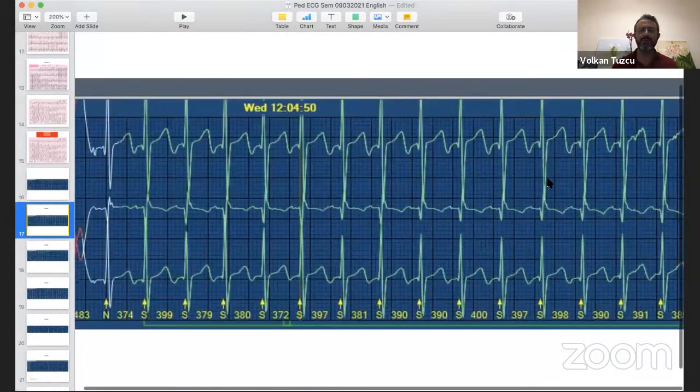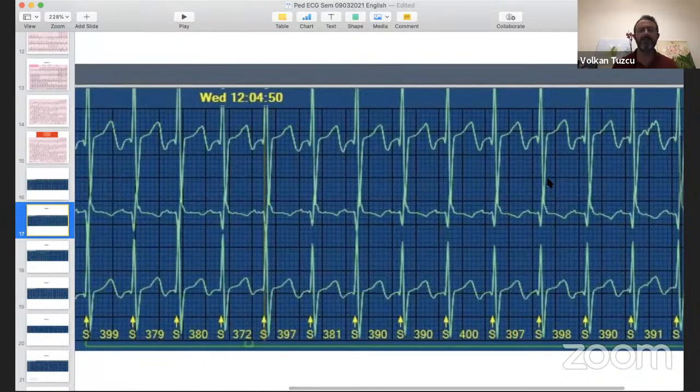If they just show you this, focal atrial tachycardia is the number one diagnosis, then atypical AVNRT, PJRT. This is why when we receive Holter strips, as electrophysiologists, we always want to see how this started and how it ended.